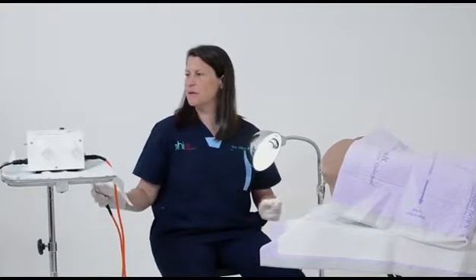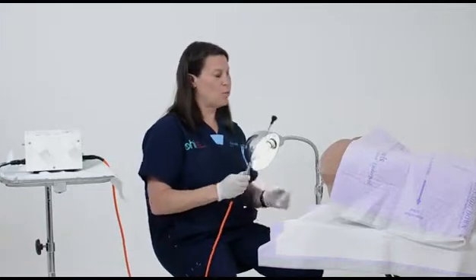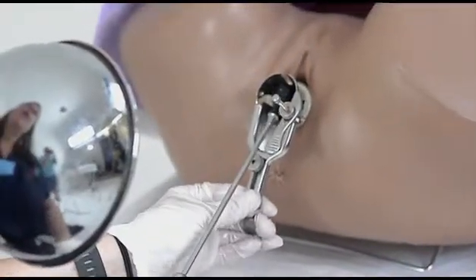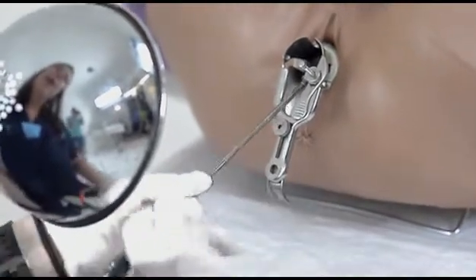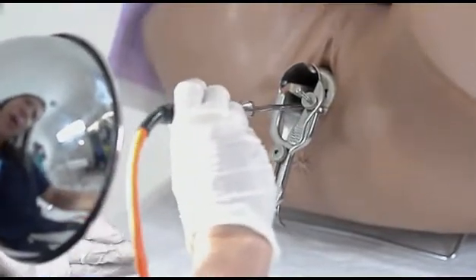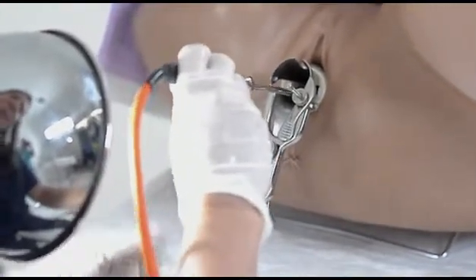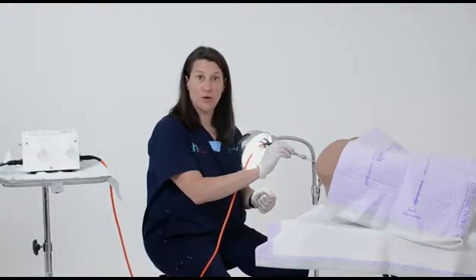So next, you use this probe. And remember, this part is hot, this part is not. What I do is use the speculum like a fulcrum — you can put the probe on at an angle and have it stabilized, put it in, reach the cervix, then lift up and you treat for 40 seconds at 100 degrees.